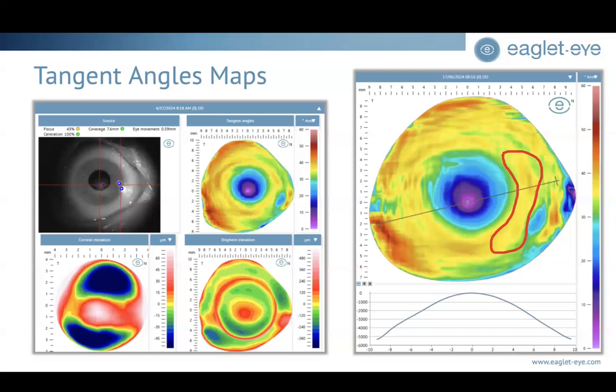And I called the patient and said, look, are you sure you took 48 hours out of your lens? And of course, not the first time in the clinic. Patients hate taking breaks from their lenses, and it turned out he'd actually only stopped wearing it the night before, which is less than 24 hours. And so in this case, the lab was right. We were just going to bring him back for a scan.